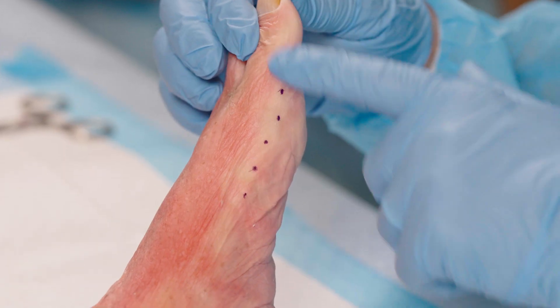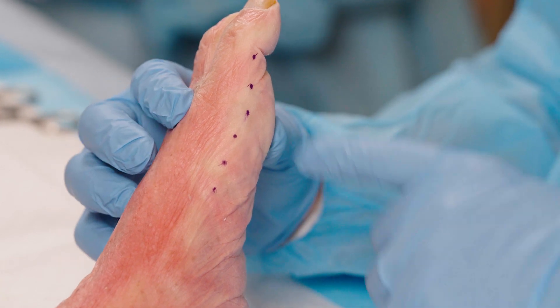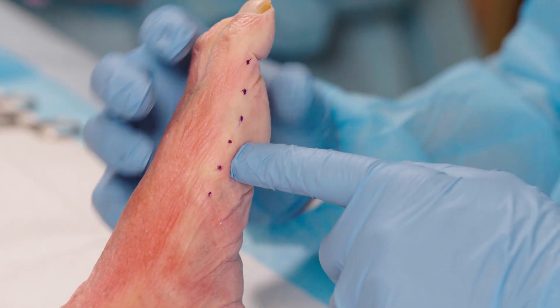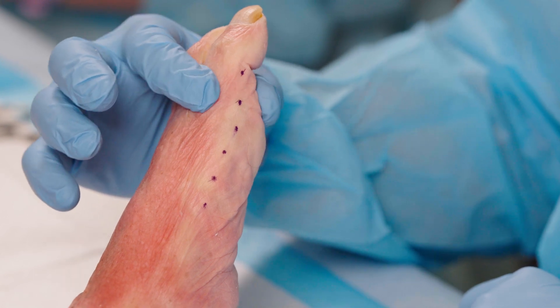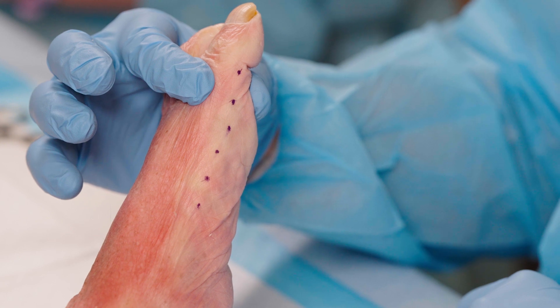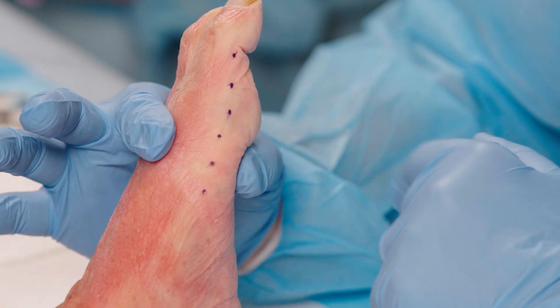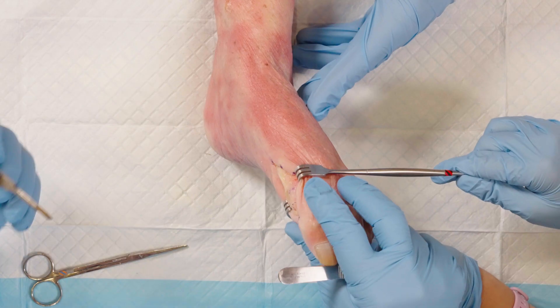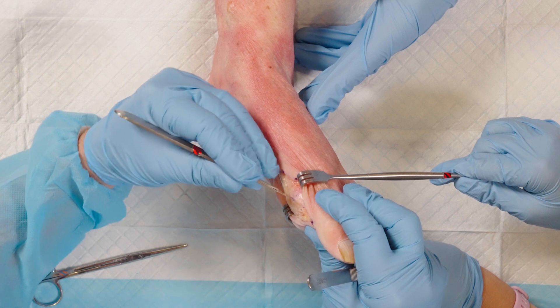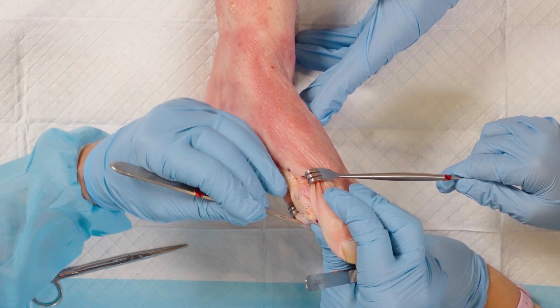I'm really excited to add OSSIOfiber to the mix and I'll demonstrate that today. First, I've outlined the incisional approach. We do a dead medial approach, which is the interface between the dorsal and the plantar skin. The way I decide where my incision is — I put my finger and thumb on the dorsal and plantar aspect of the proximal phalanx and I split the difference. Then I come to the metatarsal, split the difference, and all the way back. My capsulorrhaphy is a long incision as far proximal as the periosteum.